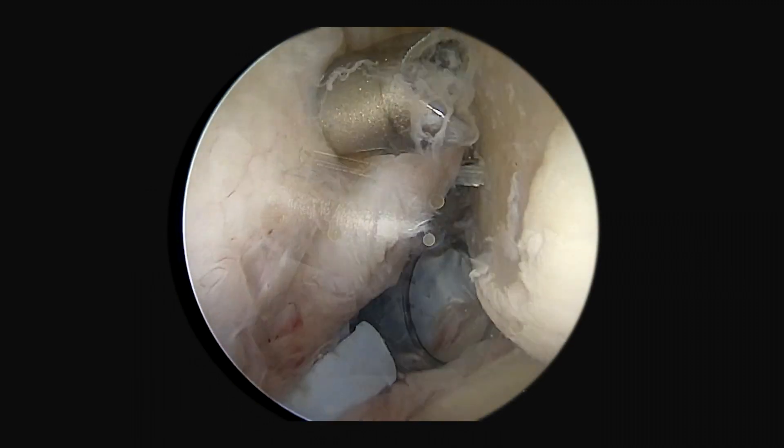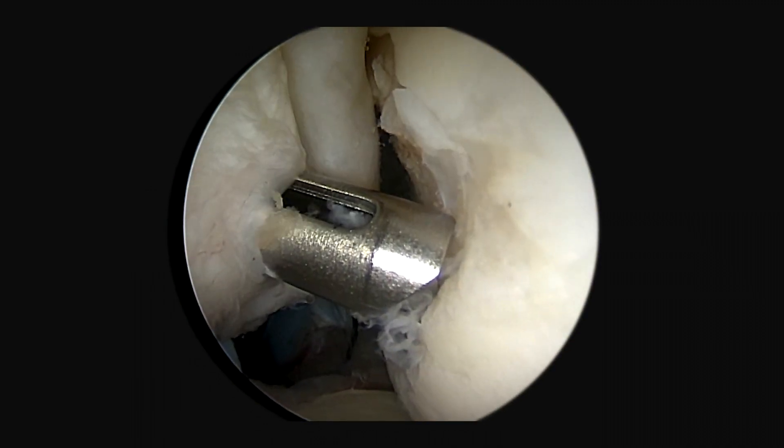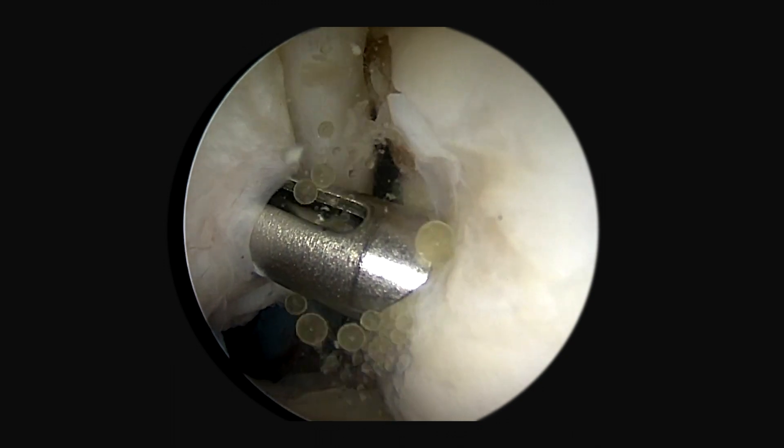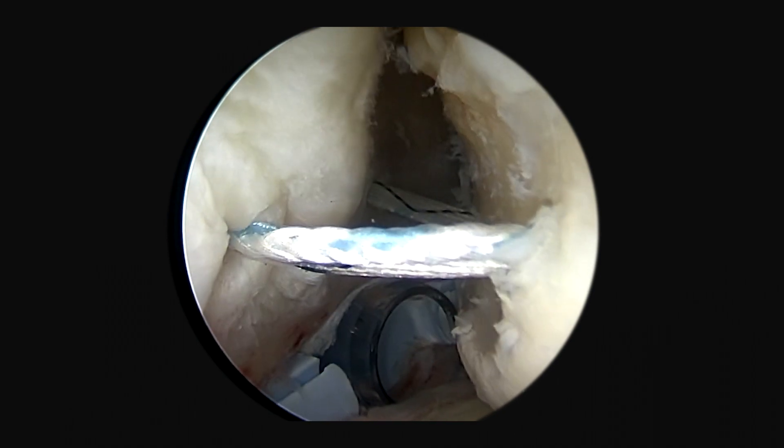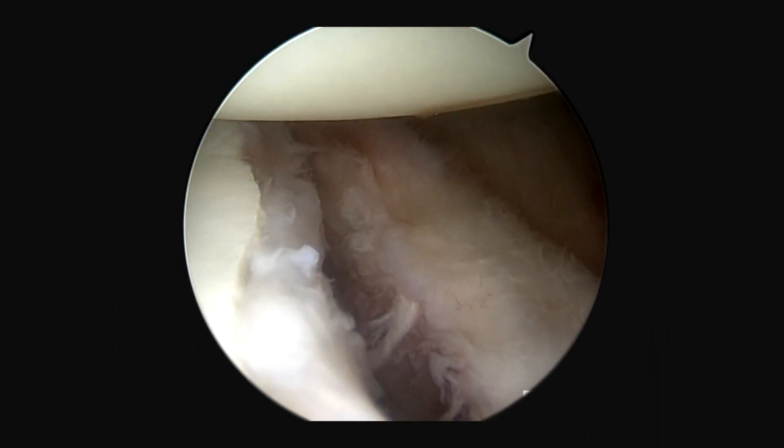Through that cannula, I can penetrate percutaneously through the capsule and the tendon with my knotless fiber-tack anchor. We want to first place our anchor inferiorly, then through that same cannula place the second anchor more superiorly. In doing this, the sutures from both anchors come out through that same cannula. We'll drill the superior anchor and place the fiber-tack anchor, setting us up for the subsequent remplissage.